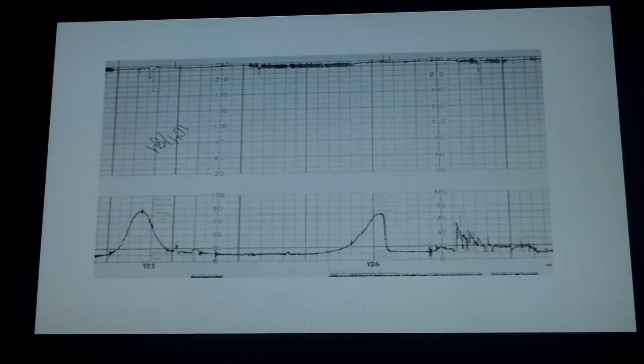So on that, you're going to troubleshoot your monitor, make sure that that's really what's going on there, and also put the pulse ox on. Keep in mind that that could be a half of a rate. That might be half of that. So you'll need to go through your steps to troubleshoot your monitor and make sure that's what it is. And rely on your hands and ears, and maybe take the monitor off and get a Doppler and try to auscultate and see if you can hear anything, and try to count that to see if that's actually what you're hearing.